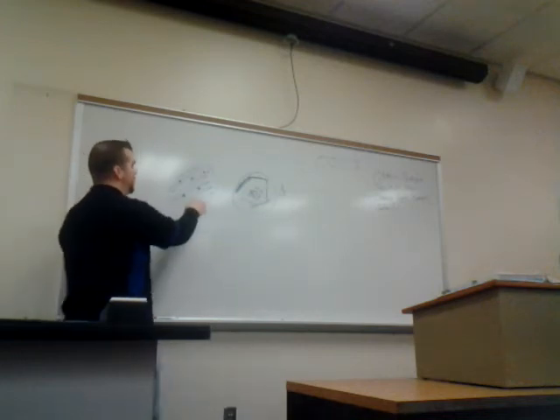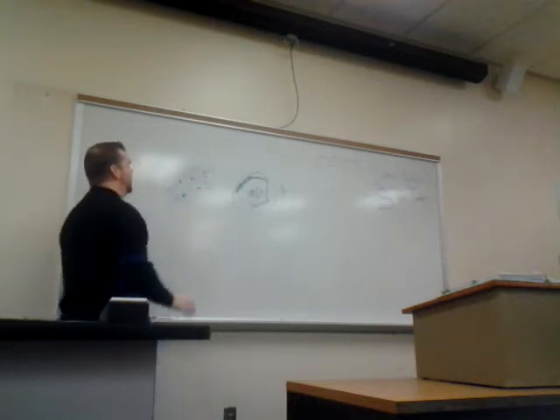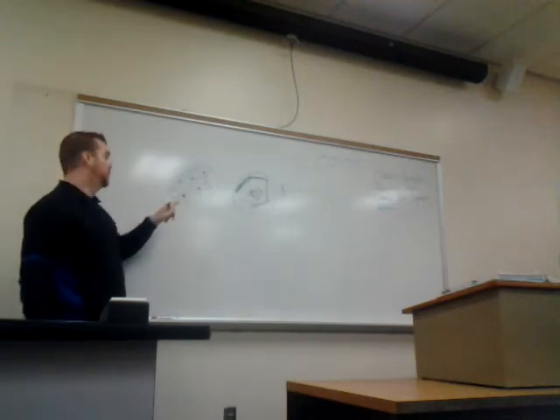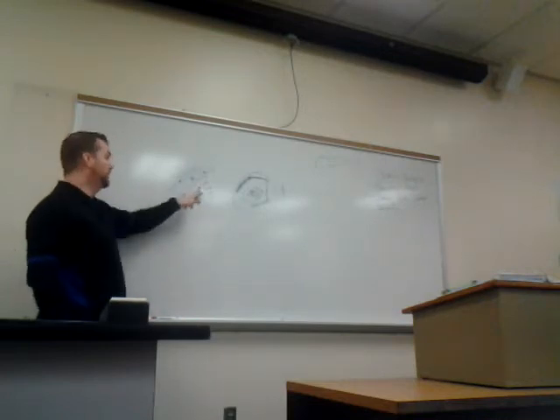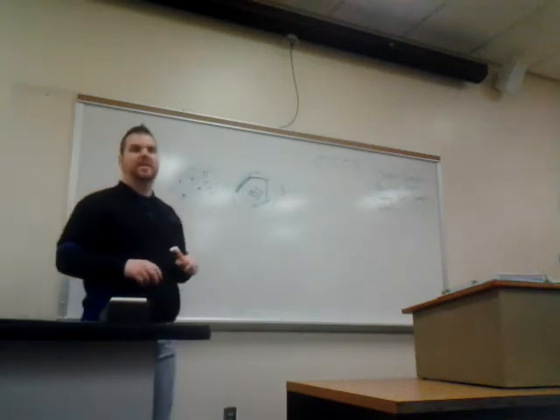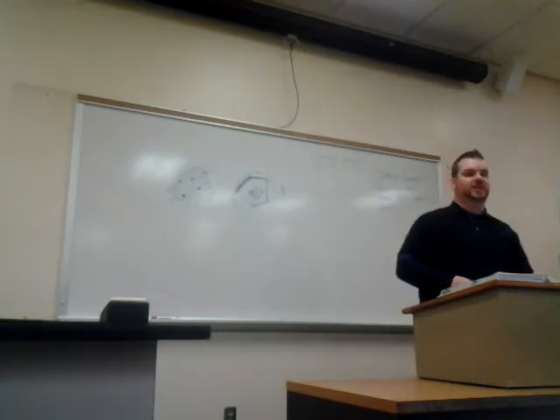Okay? So you have some with little clear zones, you'll have some with really big clear zones. So they really are effective against this bacteria. Some of these other ones that don't have any wouldn't be effective at all. So we want to give patients this one, not this one. Does that make sense? In this picture, basically all of them are effective, because they have the clear zone around them.